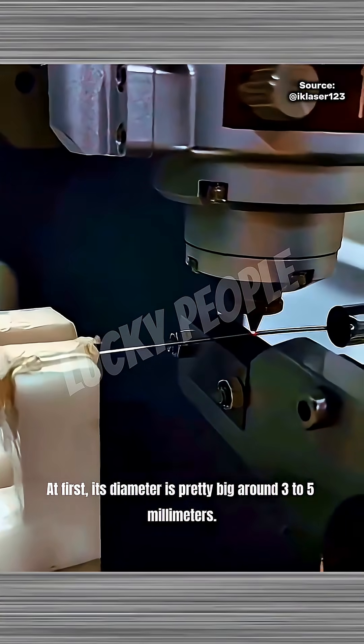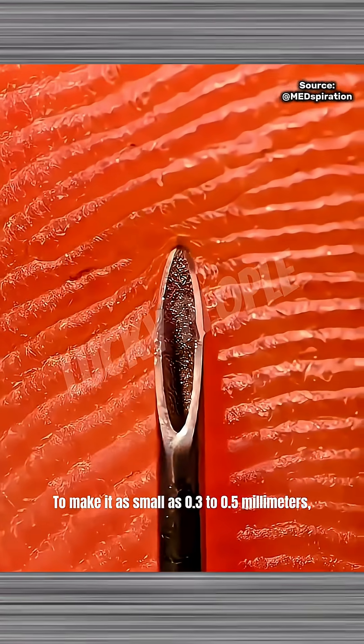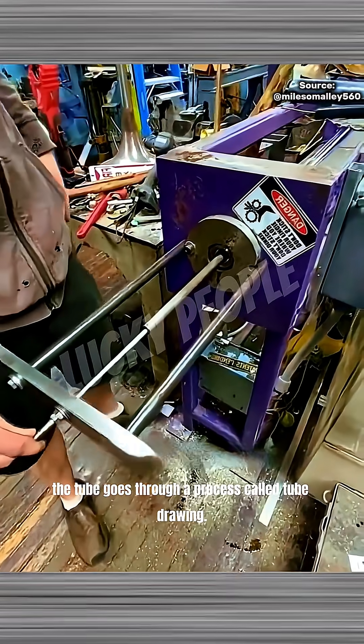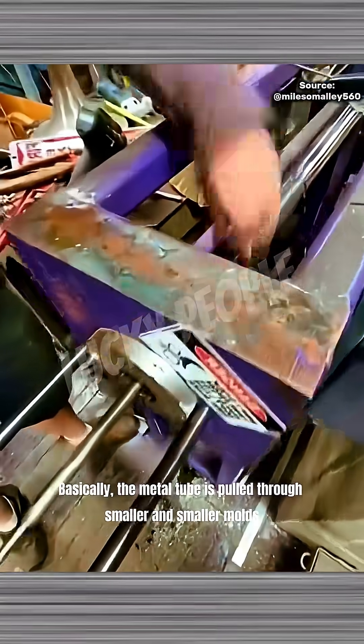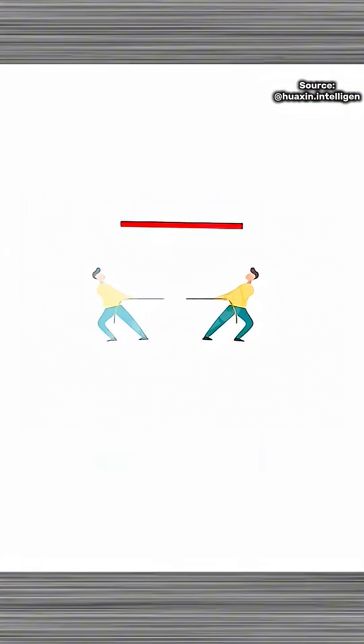At first, its diameter is pretty big, around 3 to 5 millimeters. To make it as small as 0.3 to 0.5 millimeters, the tube goes through a process called tube drawing. Basically, the metal tube is pulled through smaller and smaller molds until it reaches the desired diameter.